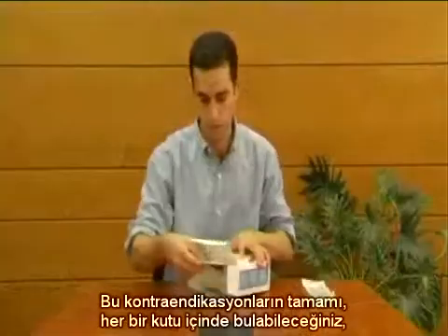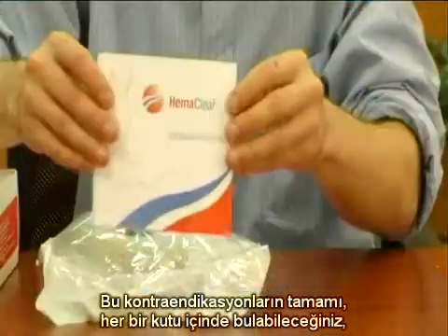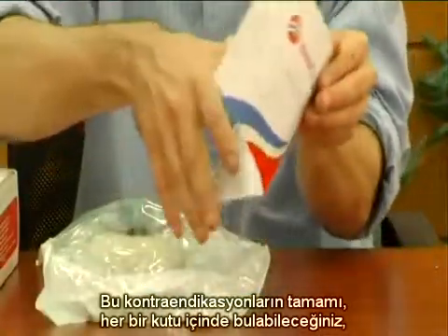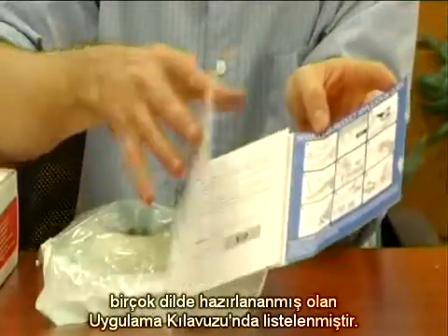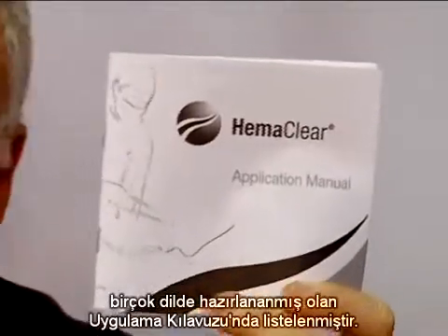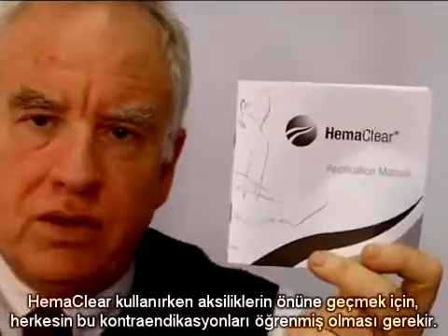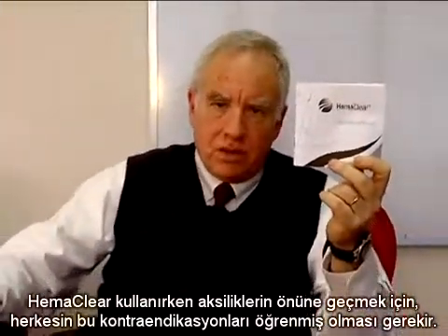These contraindications are listed in the insert that you will find in each box called the application manual, and you will find it in many languages. Everyone should be familiar with those contraindications to avoid mishaps with using the HemaClears.